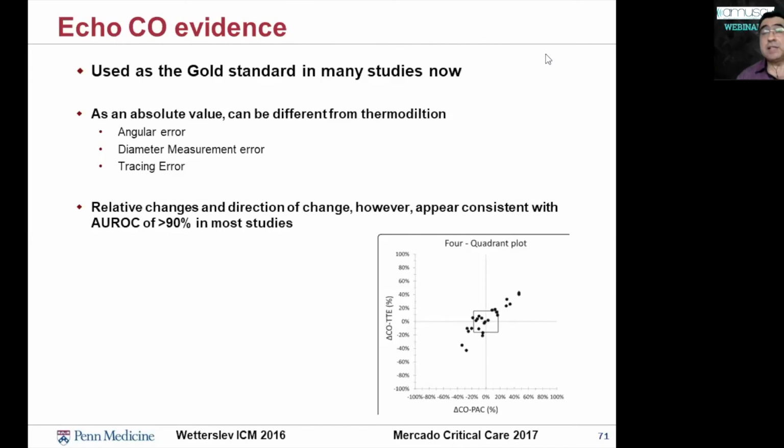Yes, and we can see patients with a collapsed IVC with very low ejection fraction, or we can see patients with a huge inferior vena cava, but it's a chronic dilated IVC, and the patient still responds to volume, etc. Well, there are some questions, Cameron, if you allow me. One person is asking about the Doppler, the renal Doppler. What is your opinion about using the renal Doppler in patients with shock?